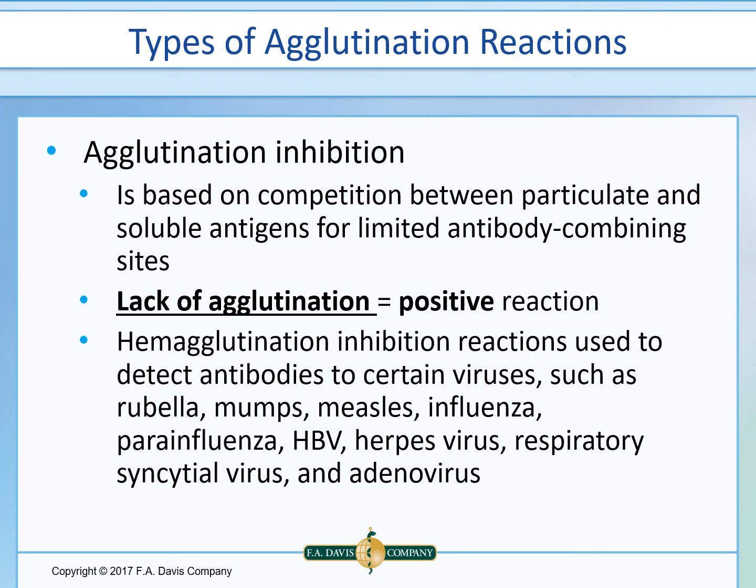The patient sample is first reacted with a limited amount of reagent antibody that's specific for the hapten being tested. Indicator particles that contain the same hapten that one wishes to measure in the patient are then added. If the patient sample has no free hapten, the reagent antibody is able to combine with the carrier particles and produce a visible agglutination. In this case, agglutination is a negative reaction, indicating that the patient did not have sufficient hapten to inhibit the secondary reaction.